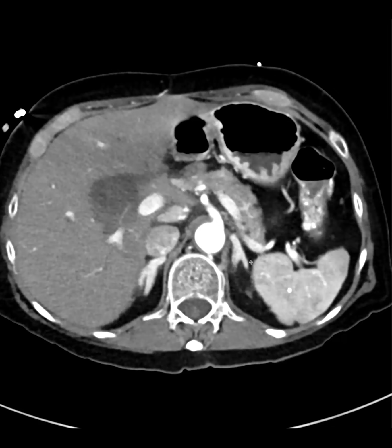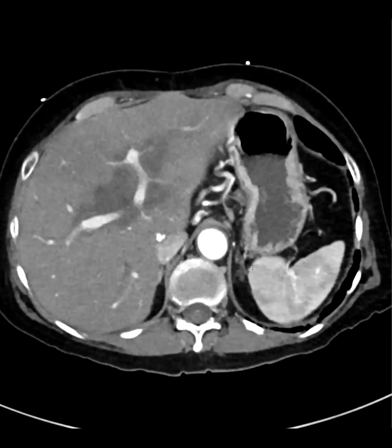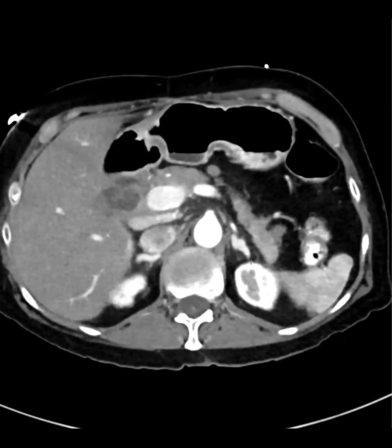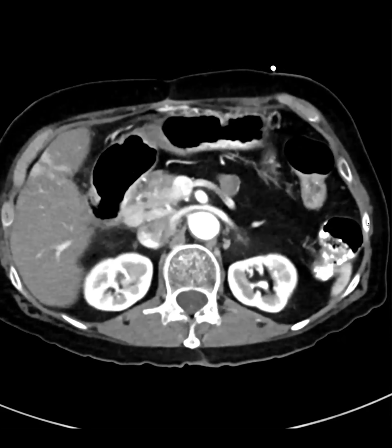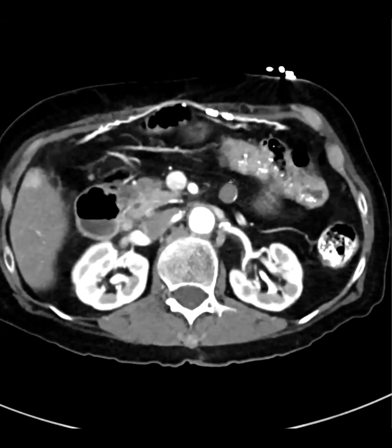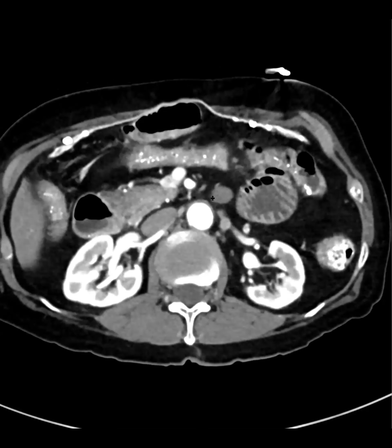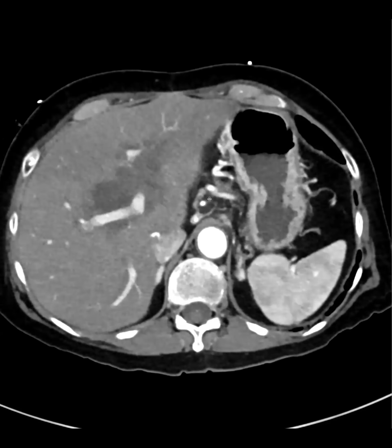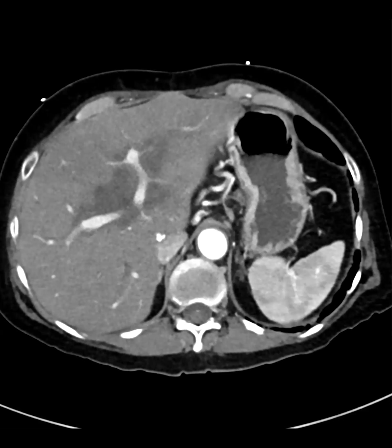So this was a patient who had a remote transplant nearly a decade ago, and then followed up elsewhere, and then came in with elevated transaminitis. And then we got imaging, which looked like this. So the patient had an aortohepatic artery conduit right here, and that's occluded, like you can see. And then more importantly, the patient had all of these central hypodensities. Any thoughts about what you think that is?